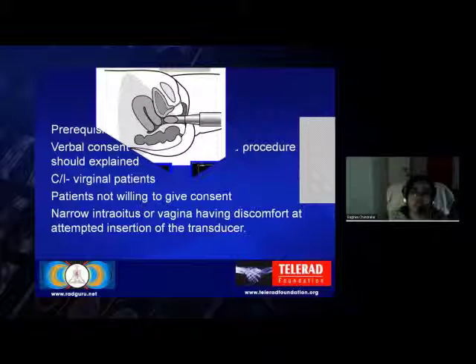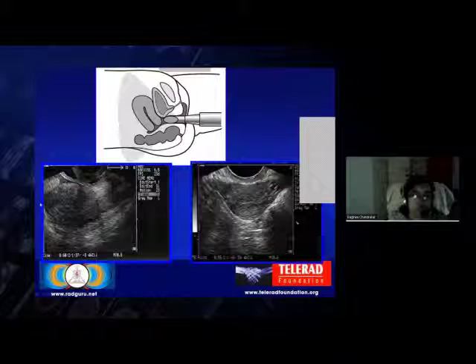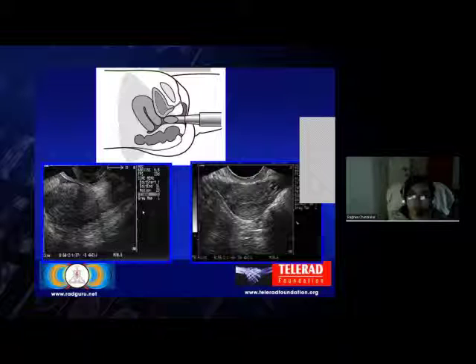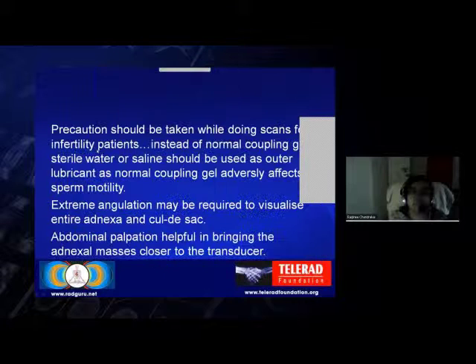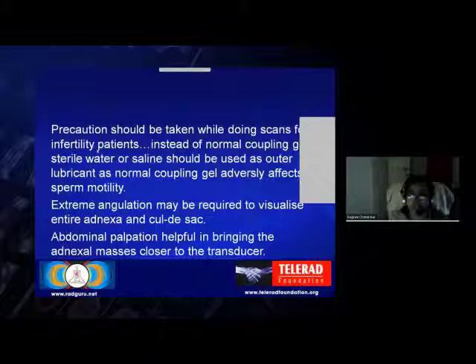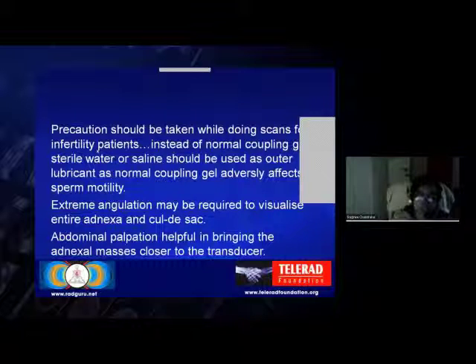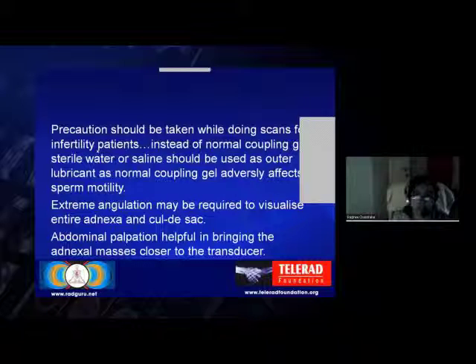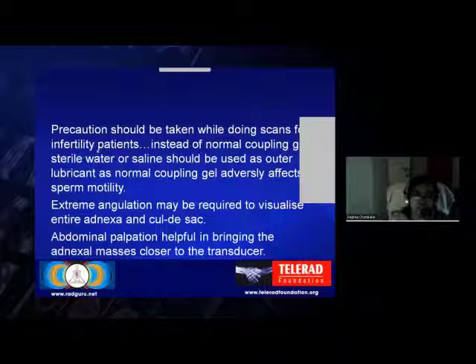As seen in this line diagram, the transducer in the vagina allows visualization of the uterus in sagittal and coronal planes. The resolution in transvaginal scan is definitely much better than in transabdominal scan. Precaution should be taken for infertility patients: instead of normal coupling gel, sterile water or saline should be used as the outer lubricant, as normal coupling gel adversely affects sperm motility. For visualizing the adnexa, extreme angulation may be needed, and abdominal palpation can help bring the region of interest closer to the transducer.